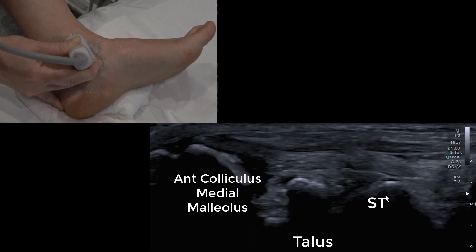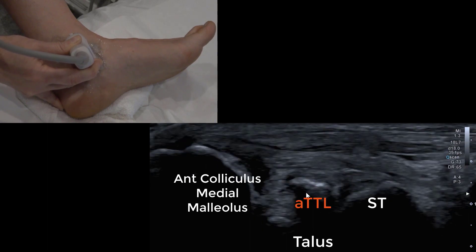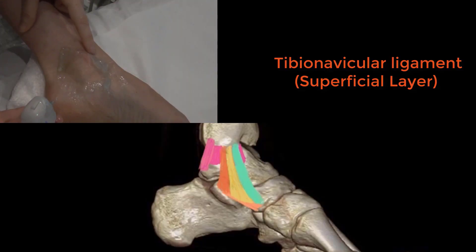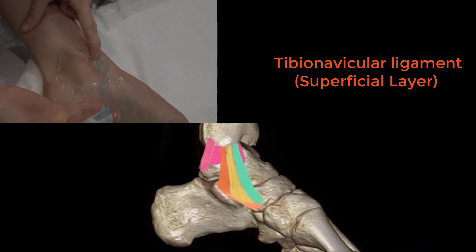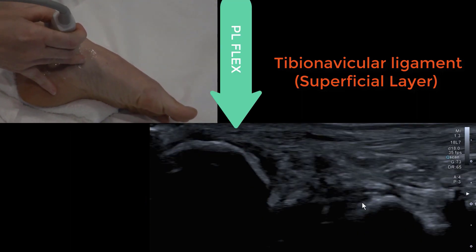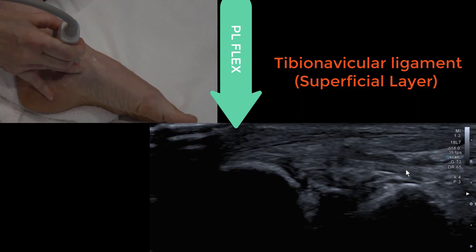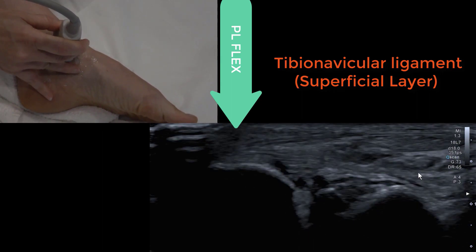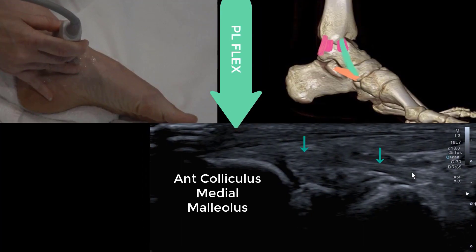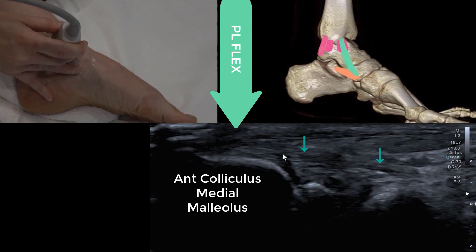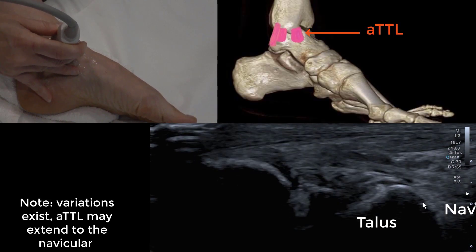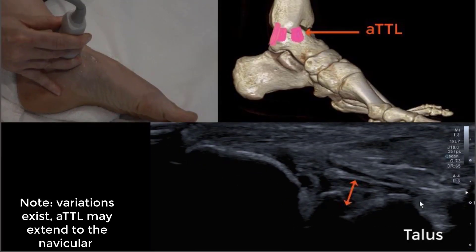At the sustentaculum, if you see a little ligament there, that's the anterior tibio tali ligament, which we can see partially under spring but partially under the next ligament — the tibio navicular ligament. It's the most anterior, the thinnest, and the hardest to find. Best seen with plantar flexion. You can see it sneaking from the front of the anterior colliculus over the talus onto the navicular. It's the most commonly injured of the deltoid complex. You can also see a little ossicle in the anterior tibio tali ligament beneath the tibio navicular ligament.